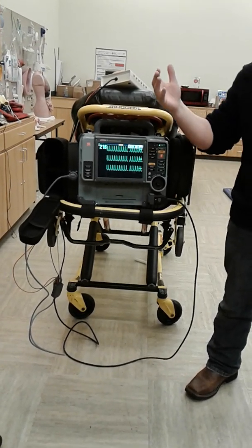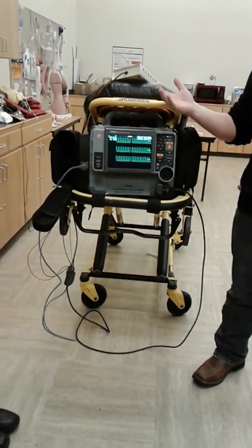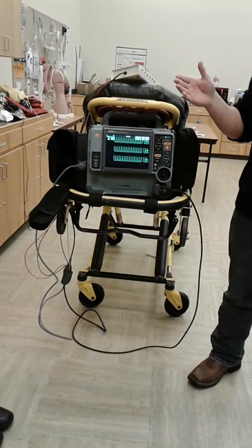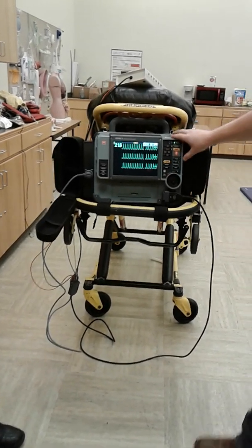It's kind of like when you write in a medical journal. You write the abstract to favor you, do you not? Okay, same thing here. My patient was sick, I fixed them. Okay? So we come in here, we choose we're going to cardiovert them.